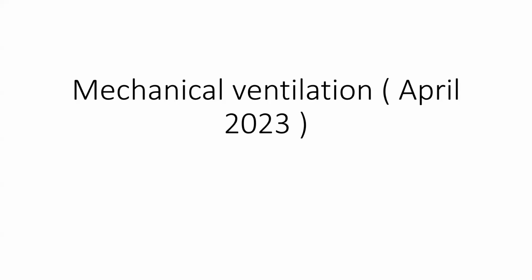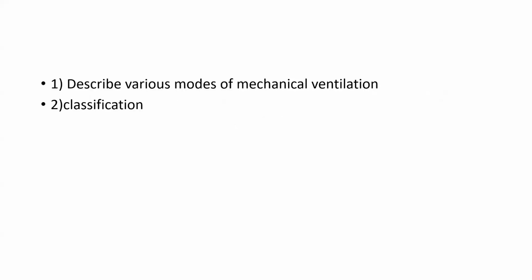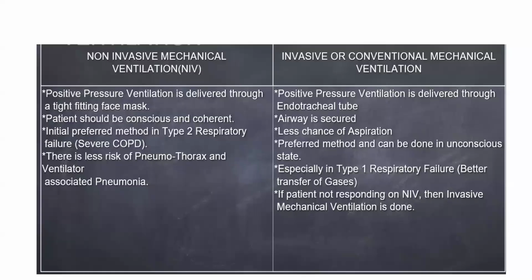Hello everybody. Today we are going to discuss mechanical ventilation. So there are two types of mechanical ventilation: non-invasive mechanical ventilation and invasive mechanical ventilation.